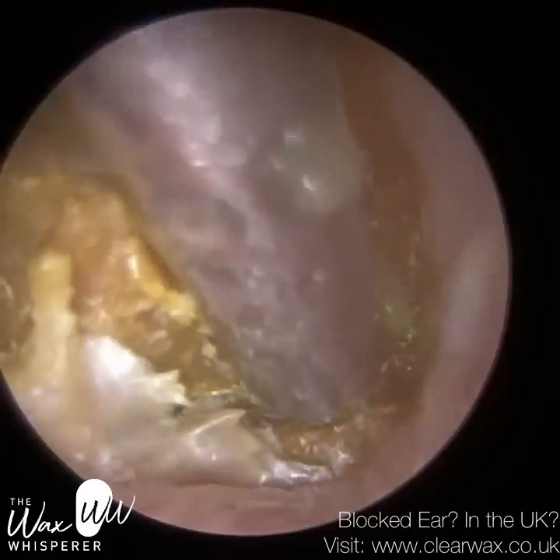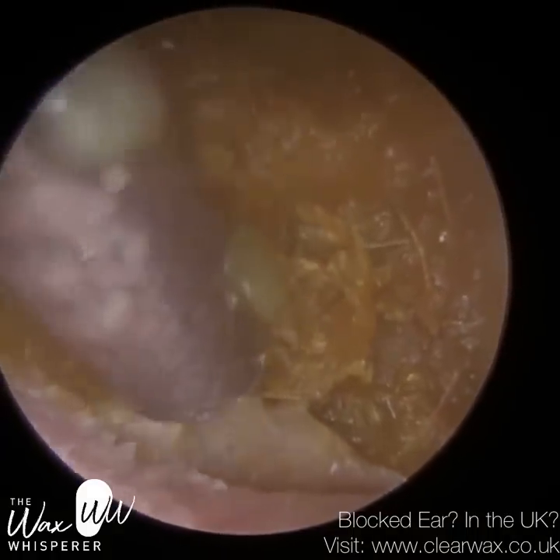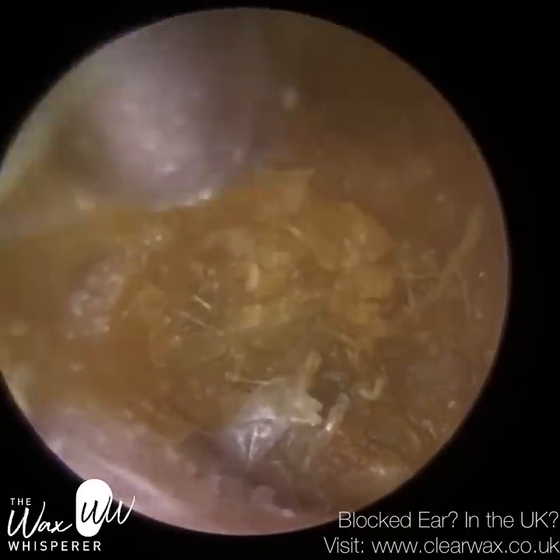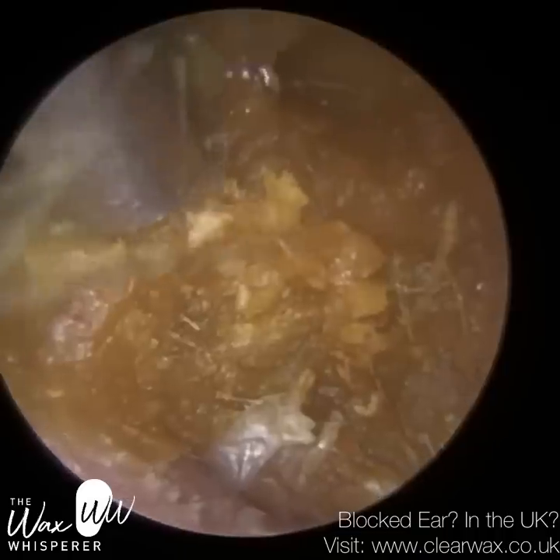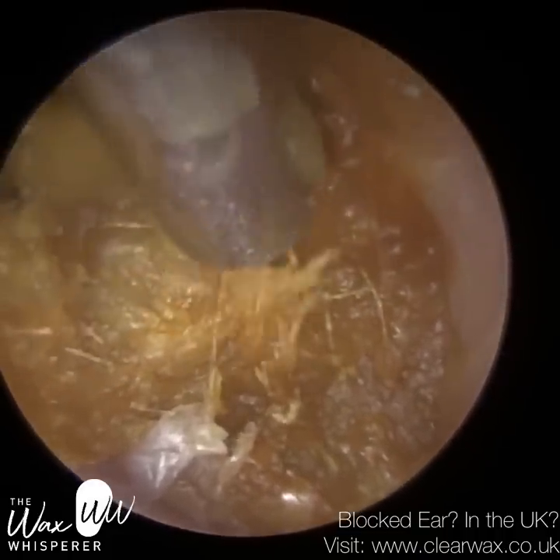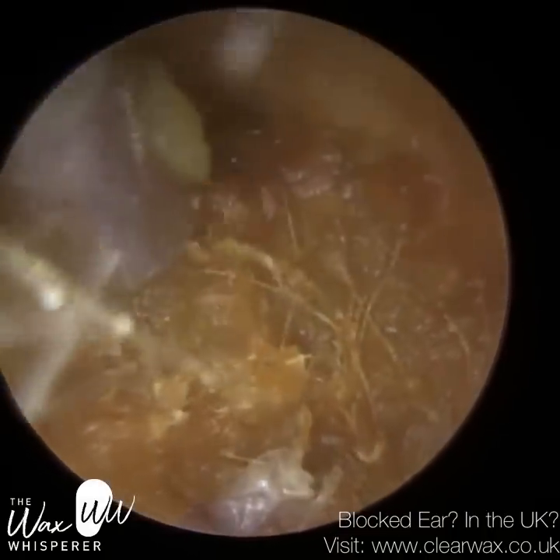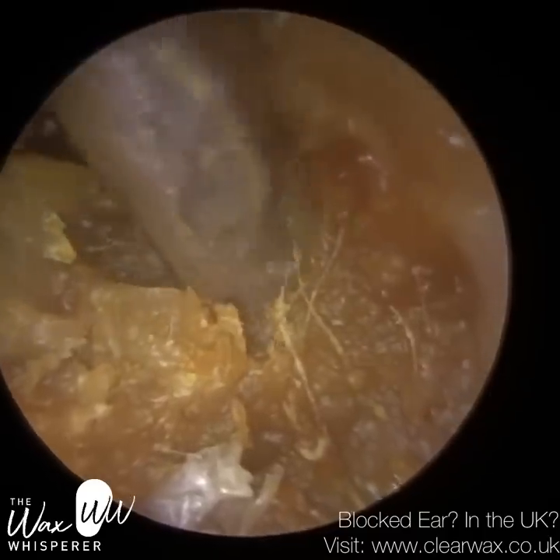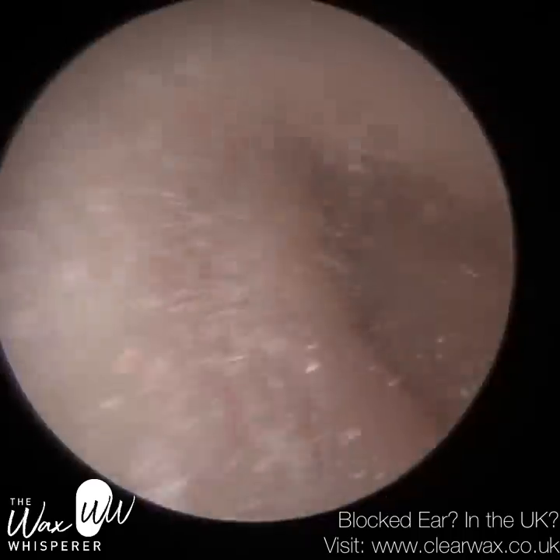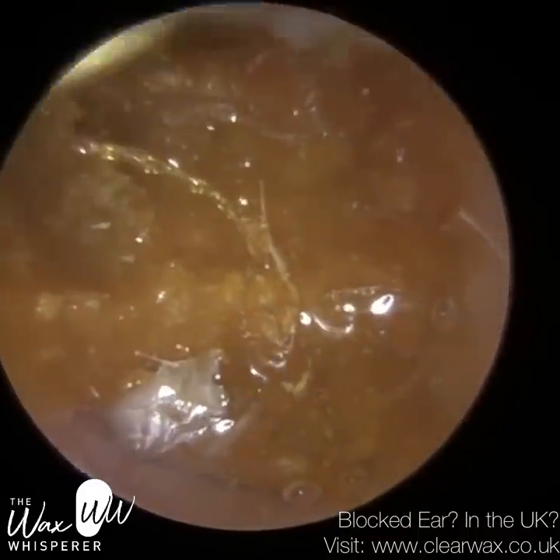With the oil, it's softened the more lateral layer of soft wax and skin. This is the more medial layer, which hasn't been exposed to the oil yet, so I'm going to put some more in. The average adult ear canal is approximately 2.6 centimetres, and this patient's was blocked right from the entrance to the eardrum. Where we're working now is about a centimetre from the eardrum — we've already removed a substantial amount of wax and skin.